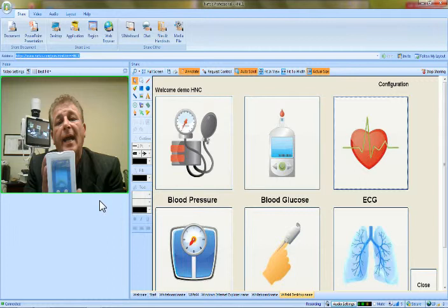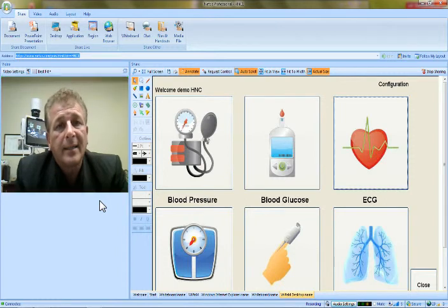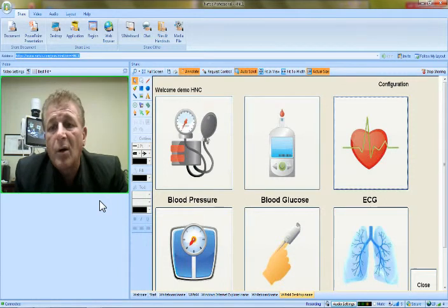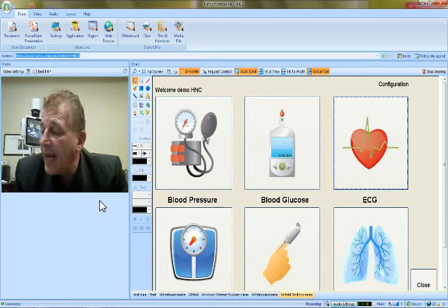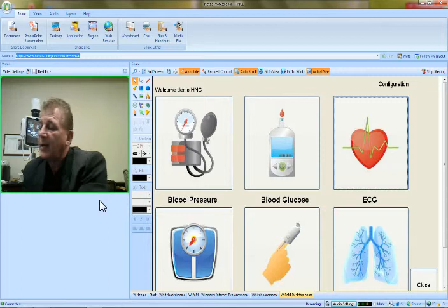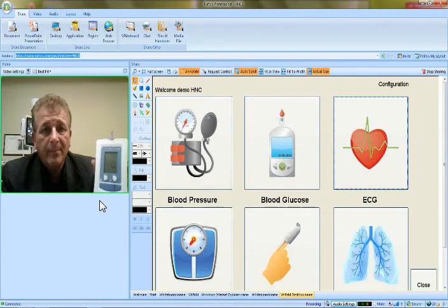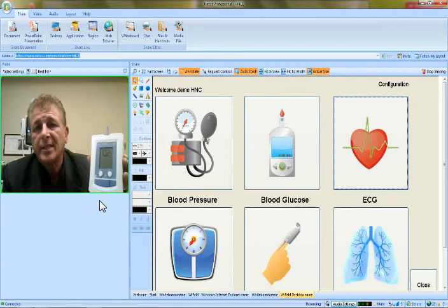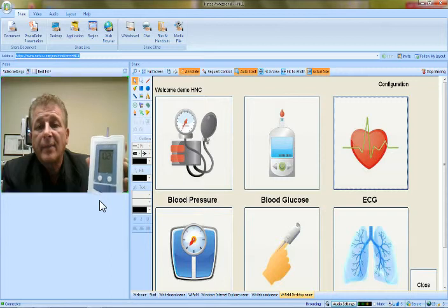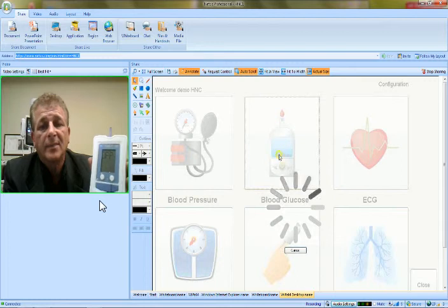So the patient would have this, and they would simply put a strip in the top of this, and I'm going to actually do that for you right now. And then they're going to lance their finger and put a small drop of blood on the end of that. And then what happens is, I'll just kind of hold this up and share with you what we do. It starts to count down. And we tell the patient, when the blue light's flashing, it's time to touch the screen. So this screen you see on your screen is covering their entire screen. And then they simply touch the screen where it says blood glucose, and it sends their results within a matter of seconds.